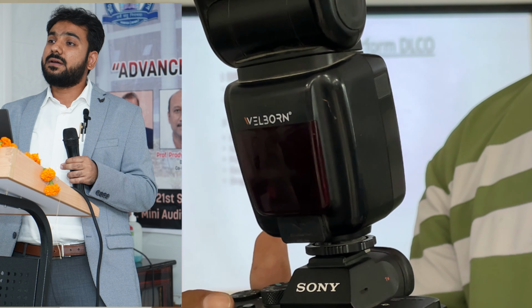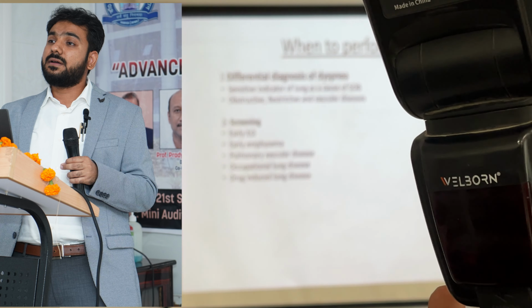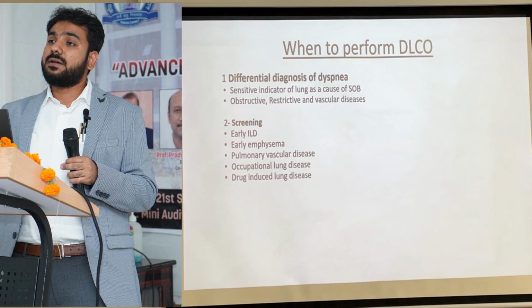Now the second use is obviously screening. The first change that can happen in a patient of early ILD, before chest X-ray or symptoms, can be a fall in DLCO. So it can be a very sensitive predictor of early ILD, early emphysema, pulmonary vascular diseases, occupational lung diseases, and drug-induced lung disease. Before we can actually see a change on chest X-ray, performing a DLCO in a suspected patient with these diseases can give you an idea that something is wrong, and we can further investigate and evaluate that.